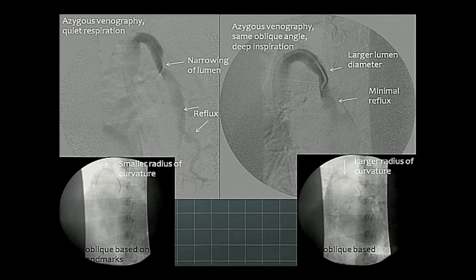And this is the same. I've looked very carefully at the bone images. This is the same. The patient hasn't moved. The tube hasn't moved. It's just due to inspiration. The whole radius of curvature increases when you take in a deep breath.